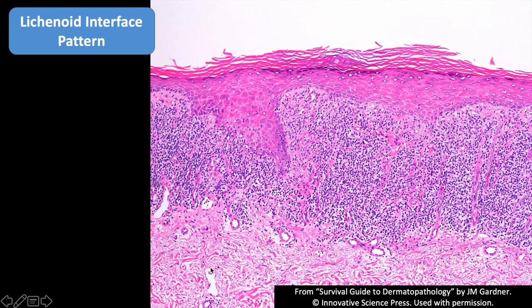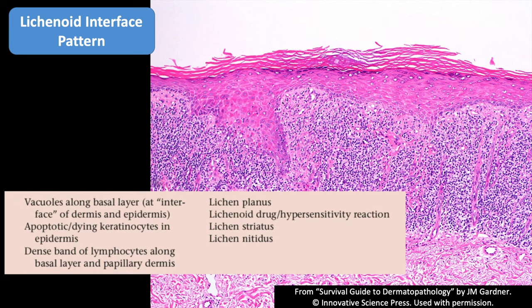If you see a thick band of lymphocytes and wonder whether this is truly a lichenoid interface, go down closer and look for dying keratinocytes. True lichenoid interface dermatitis should have dying keratinocytes at the basal layer somewhere. This is an example of lichen planus, one of the prototypic diseases of lichenoid dermatitis, but there are a variety of others that can have lichenoid change.